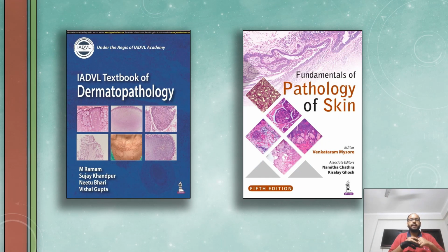So with that, we end the third part of this lecture, these special structures. And with this, this video lecture on the histology of normal dermis is finished. We'll meet again next week when we'll discuss different dermal reaction patterns. We'll discuss granulomatous pattern, mixed cell infiltrate pattern, sclerosing pattern, and we will discuss leprosy patterns in next week's video.